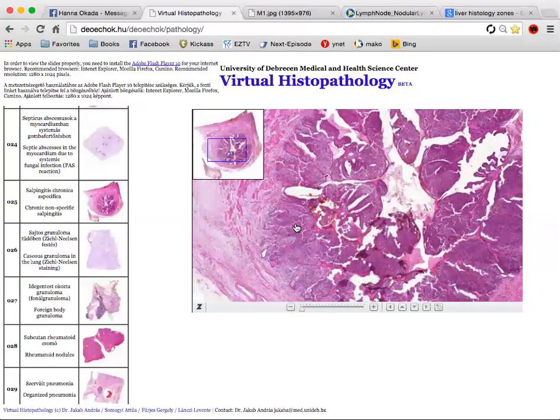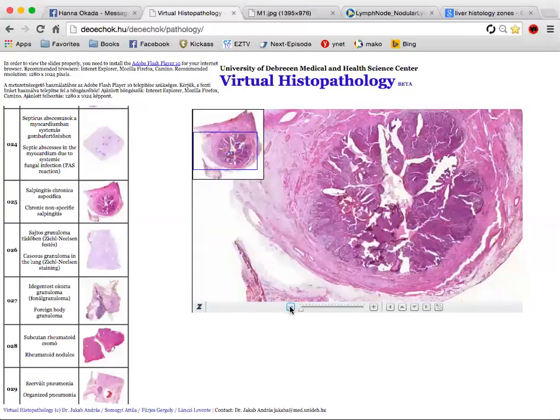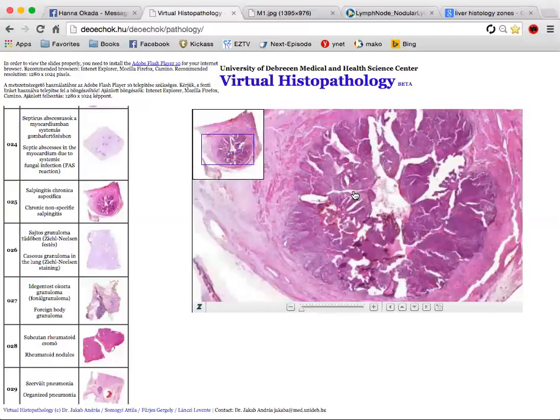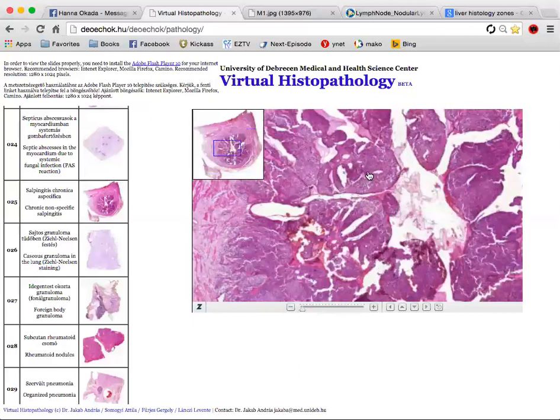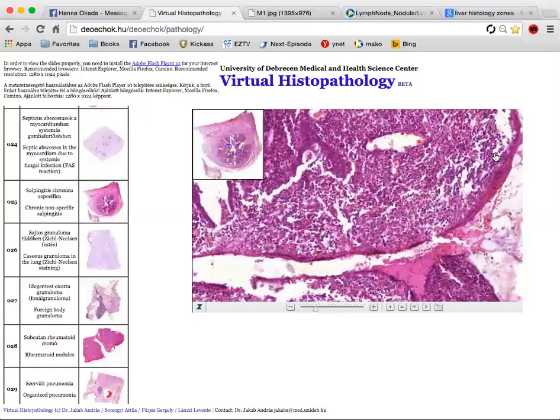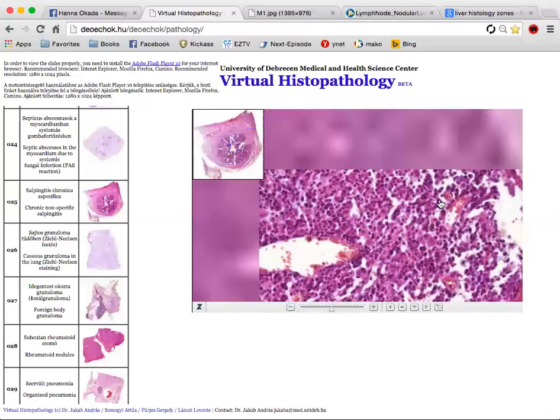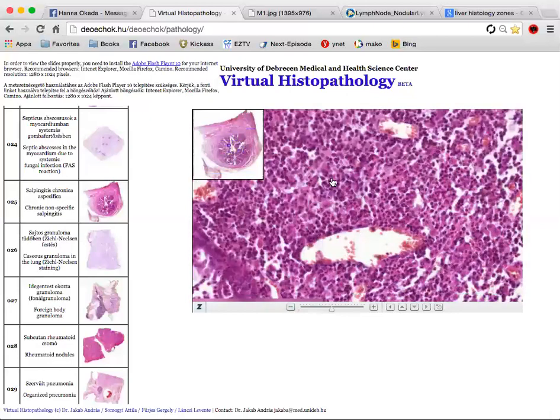Okay, so comparing to the normal villi, in the pathological situation we don't really have the lining tissue, I mean the epithelial tissue. Could you explain again? All you see here is tissue debris, so you don't see anything else. It's just tissue debris and chronic inflammatory infiltrate.